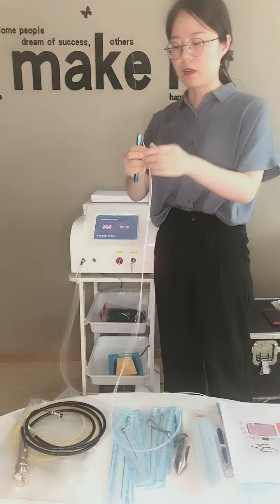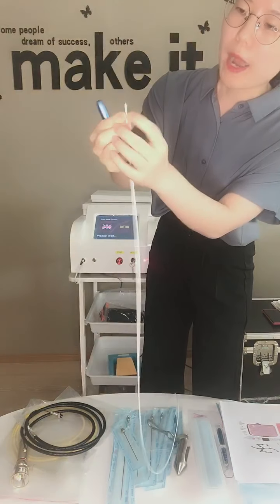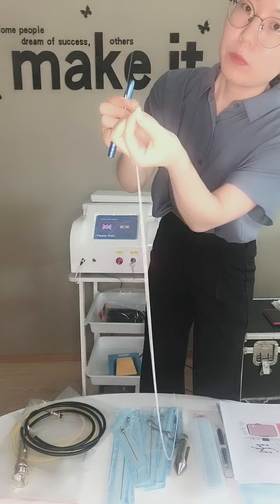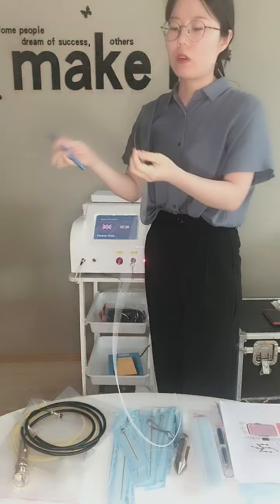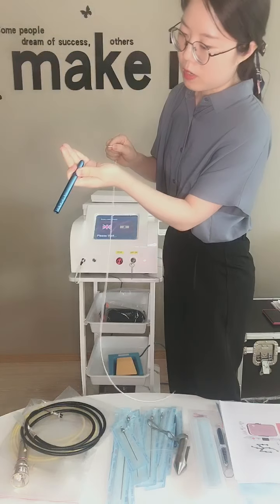And this is the fiber. On the outside of our fiber, you can see there is a white protection here, and you can just tear it out with your hand. It's very convenient. You don't need to use any knife or scissors or other tools. First, you need to install the fiber on the handpiece.